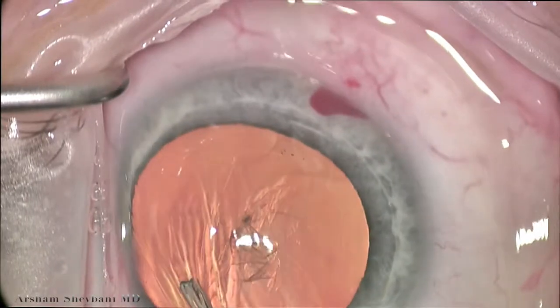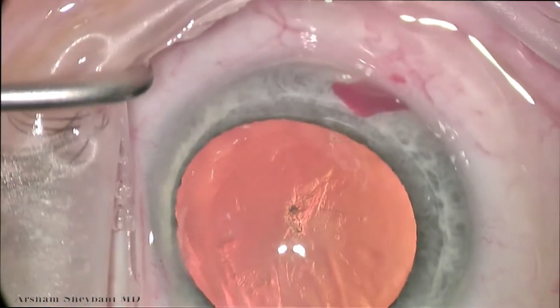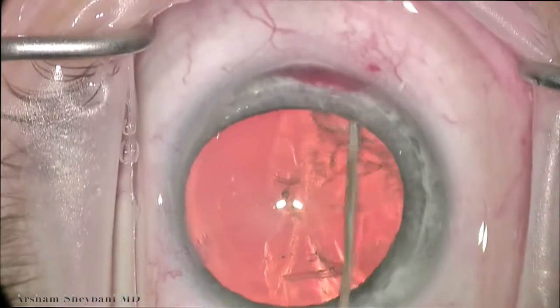And if you look superiorly, you'll start to notice that there's reflux of blood coming through that eye stent and the angle in which we placed it. That's an excellent sign.